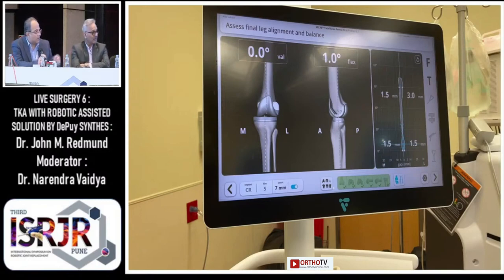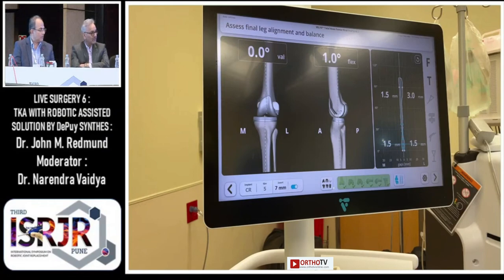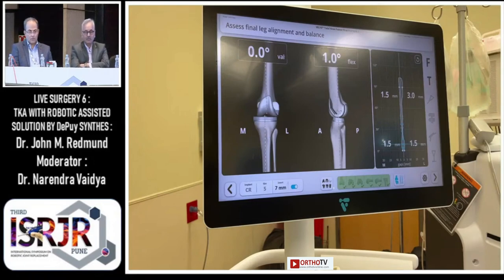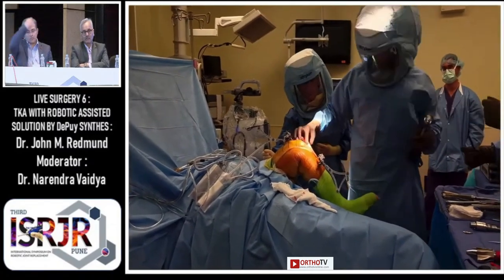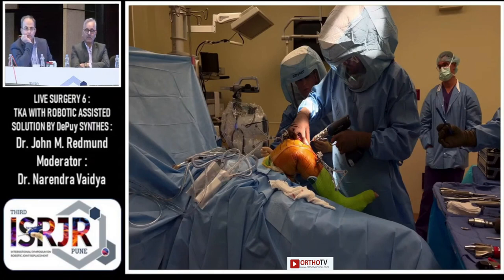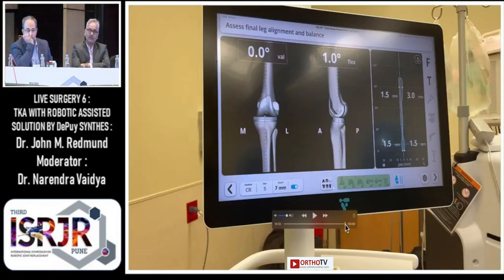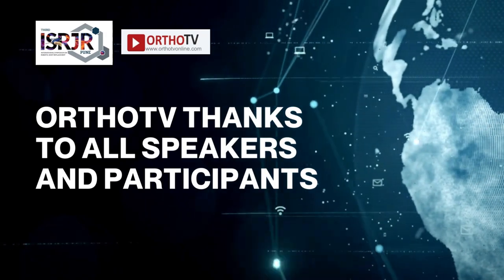Audience question: does the saw stop automatically when you complete the posterior medial or lateral cuts to prevent soft tissue damage? No — the saw will not stop automatically. This is a key difference between a CT-based system and an imageless system: the computer doesn't know where the back of the femur is, so you must use tactile sensation, just as in a manual knee, to stop the blade. You activate the trigger just like a regular manual saw.